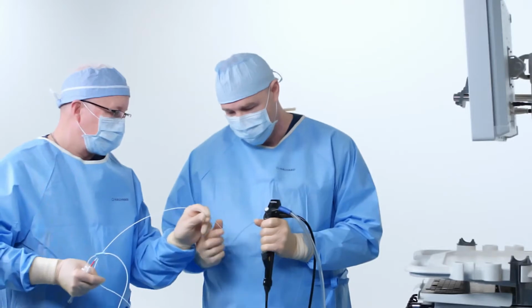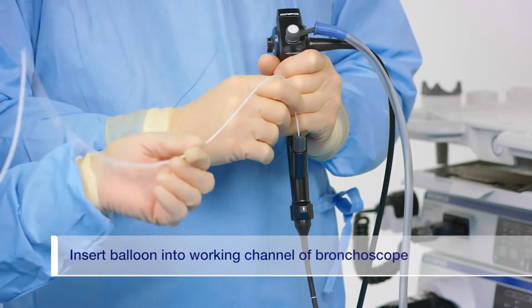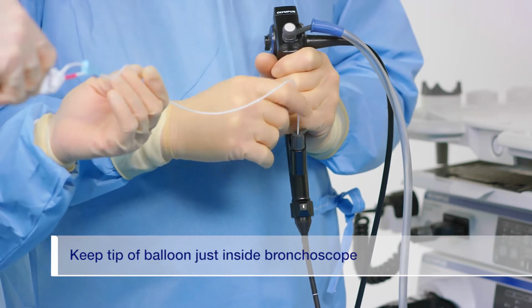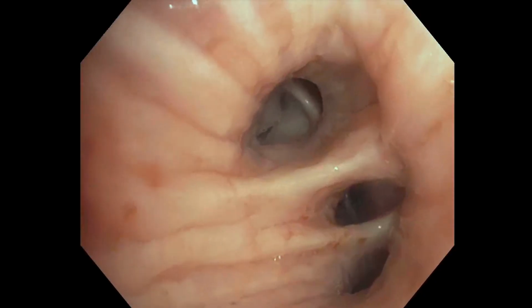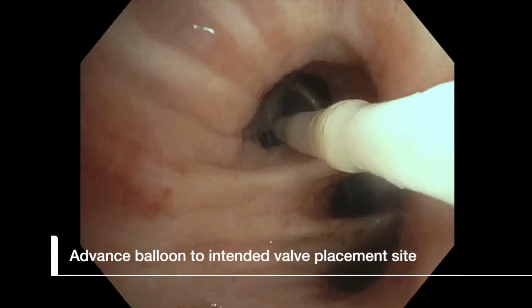To determine an airway size for appropriate valve selection, insert the deflated balloon into the instrument channel of the bronchoscope. Keep the tip of the balloon catheter just inside of the distal end of the bronchoscope while maneuvering to the selected airway. Advance the balloon into the target airway, aligning the middle or waist of the balloon with the intended valve placement site.